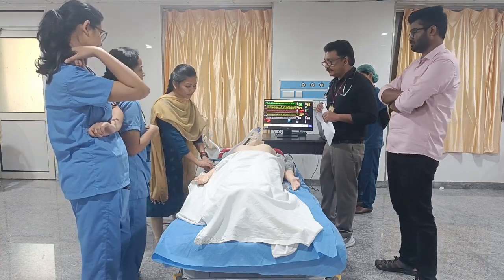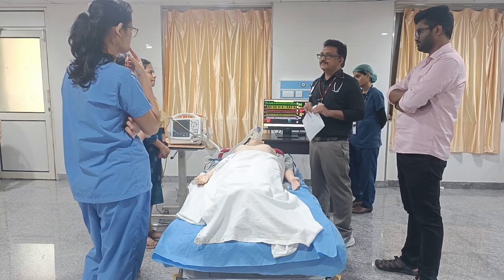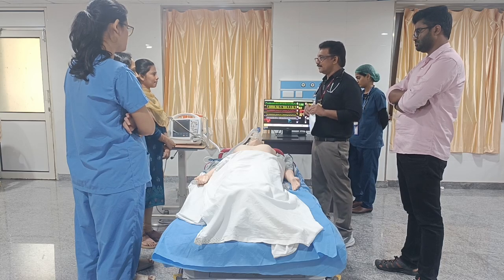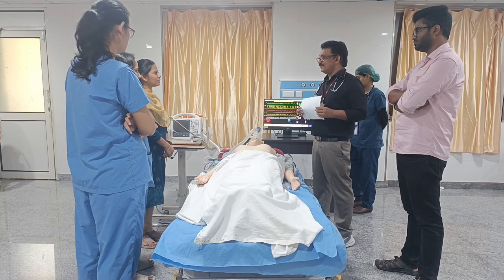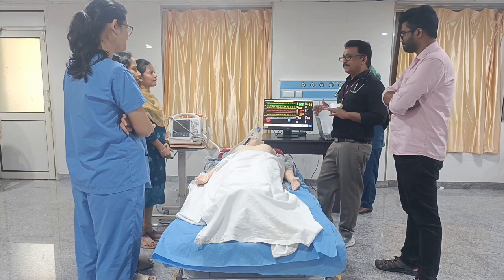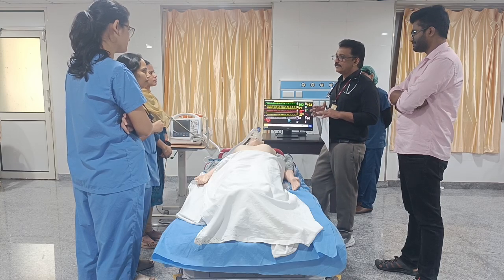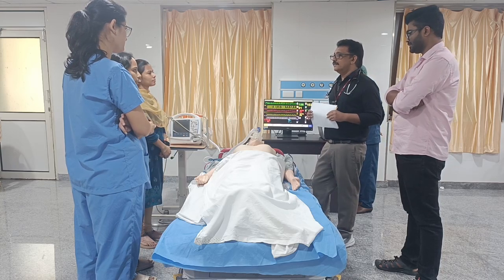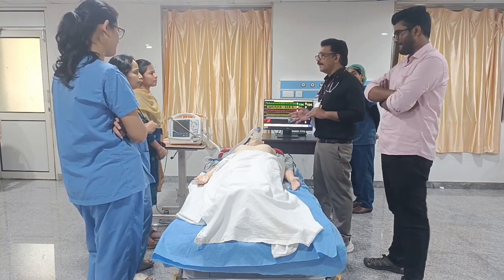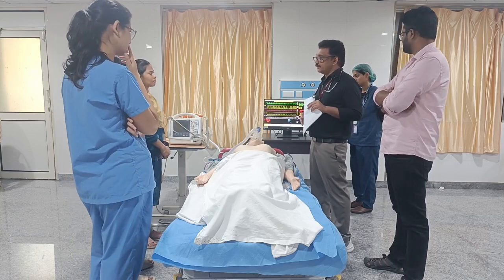We can now discuss the case, but there is a basic mistake done during the process. What was the basic mistake done? There is a basic fundamental mistake. What is the mistake, for cardioversion and sedation? You know that the patient is in pulmonary edema. You know that the patient has coronary artery disease. You have not done something which is vital for the patient. What is that? Propped up position is not done properly. The patient is still lying down. That's a basic mistake that has to be corrected. Rest of the things are okay. There is no issue.